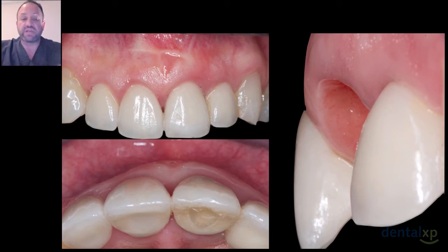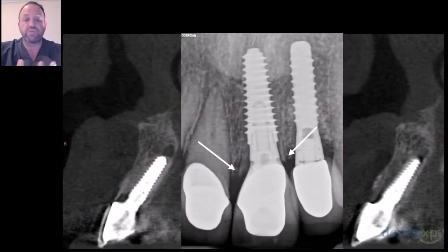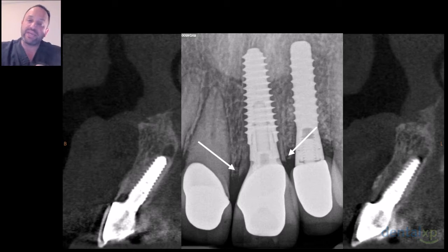Again, obviously, one says, okay, well, it's a single implant. If it's a single implant, our bone is good. And again, I will show you a case where we have put two implants next to each other, and still we are maintaining phenomenal bone. So for the first time, we have a technique which, for thin gingival morphotypes, number one, and more importantly, for multiple implants, we can maintain our papillary height, we can maintain the buccopalatal dimension. So you can see why this is such a phenomenal and fantastic technique that we can utilize in our strategies for treating immediate implants.